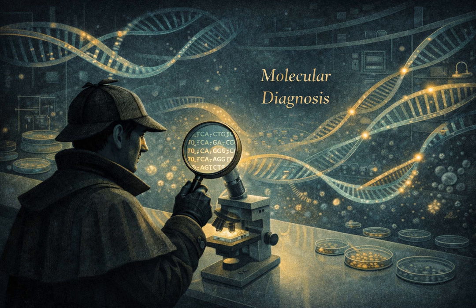Let's do it. Section 1, the detective's magnifying glass. We're talking about non-amplified nucleic acid probes. Now, probe is kind of a vague word. What exactly is a probe in this context? It's essentially a tool for finding a very specific sequence of DNA or RNA. Imagine you have a single strand of DNA from a pathogen. That strand has a unique sequence of letters, A, C, T, G. The genetic code.